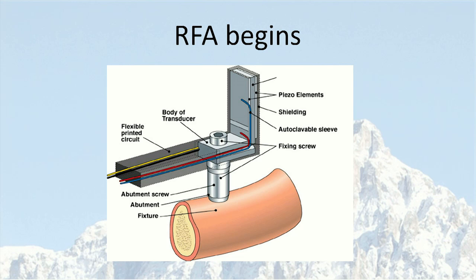So we spent like half an hour, 40 minutes, just to do the measurements in these patients. The principle at that time was to use an L-shaped transducer like this. And we have a cantilever beam on the transducer here. On each side of the cantilever beam, there is a piezo element. By introducing current into the piezo element, they will bend and stretch. And this way, the beam is excited and starts to vibrate.